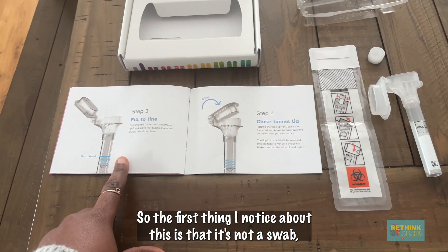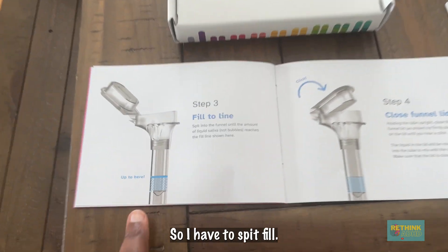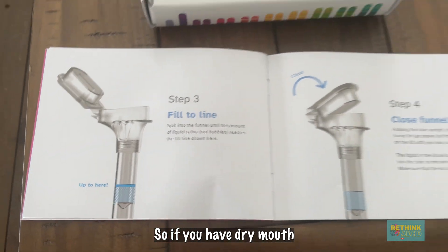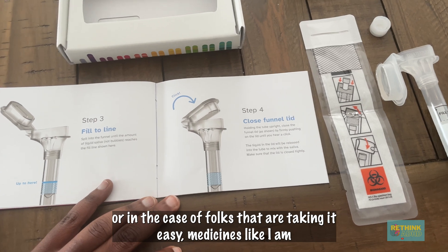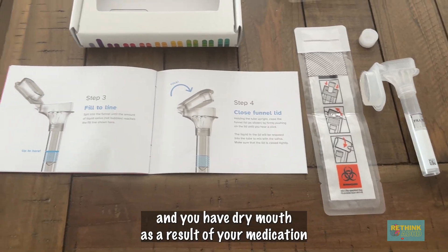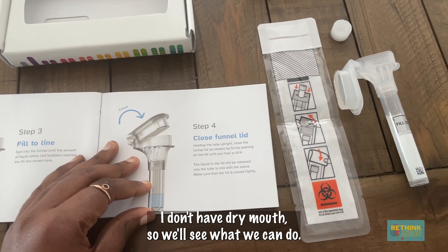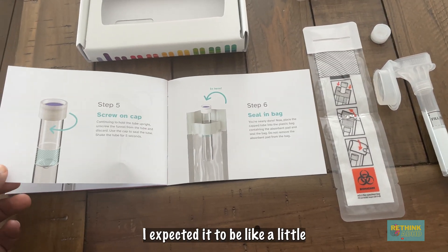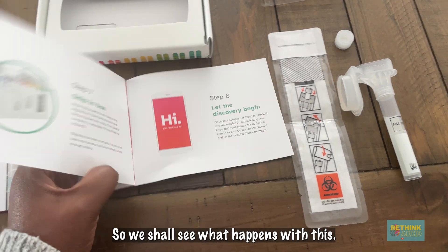The first thing I noticed about this is that it's not a swab — it's a spit test. I had to fill this thing up to here with spit. So if you have dry mouth, or in the case of folks that are taking ADHD medicines like I am, and you have dry mouth as a result of your medication, that might be a little bit of a challenge. I don't have dry mouth, so we'll see. But I expected this to be a swab — like a little Q-tip looking thing.